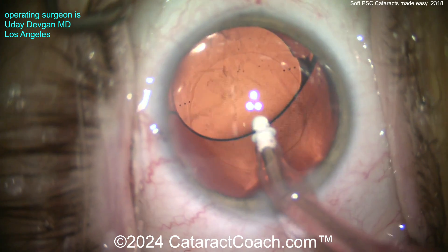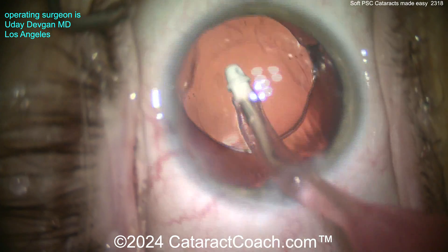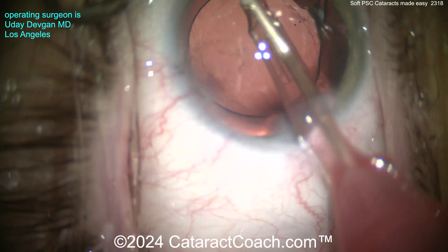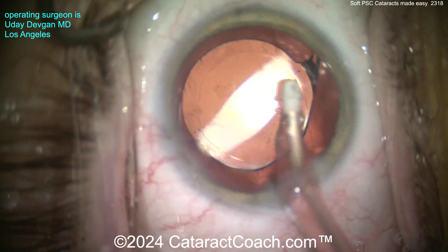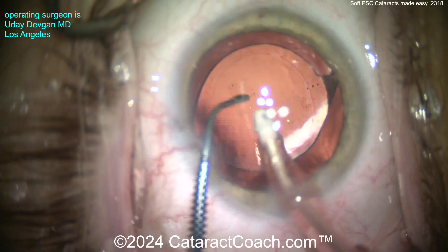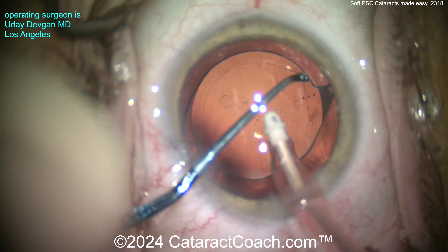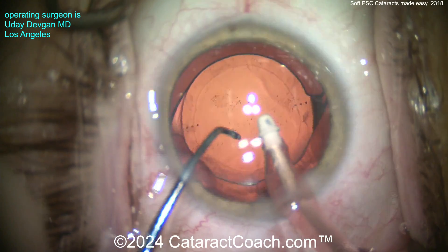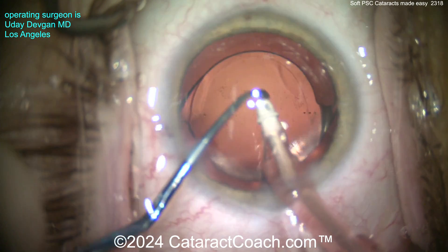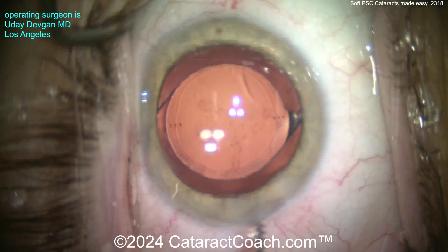Let's go behind the optic, remove the viscoelastic, and the posterior capsule should look pretty clear now — really shouldn't have too many opacities left. If there are any, we can always see the patient a couple months later. Taking out the viscoelastic and it looks beautiful. That is a forceps rhexis, and the circularity is pretty much exactly on point — I'd rather have a rhexis like this than one made with a femtosecond laser. Now lining up the toric lens to the appropriate position, nudging it to align with the marks on the cornea.